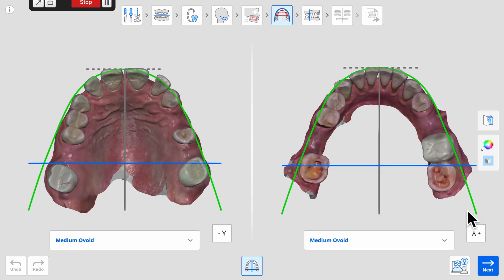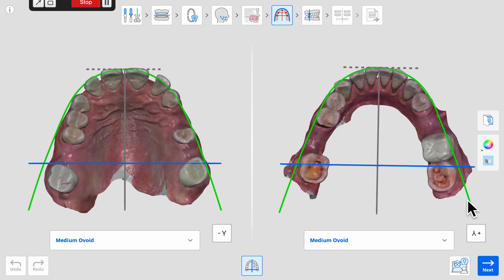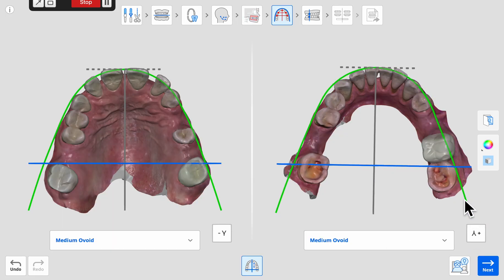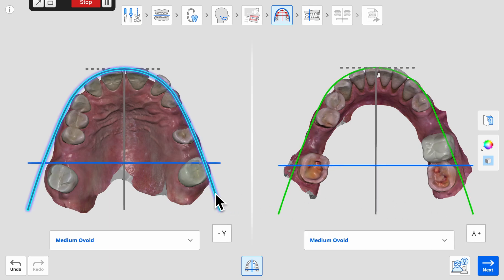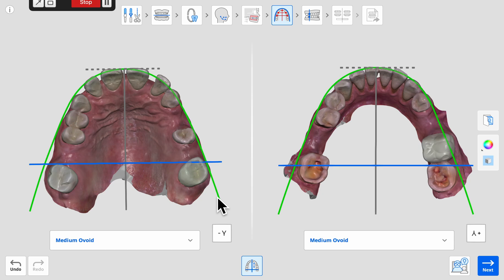The best fitting size and shape of the maxillary and mandibular arch forms are then selected as a guide to align the teeth in the transverse plane and oriented properly onto the models.